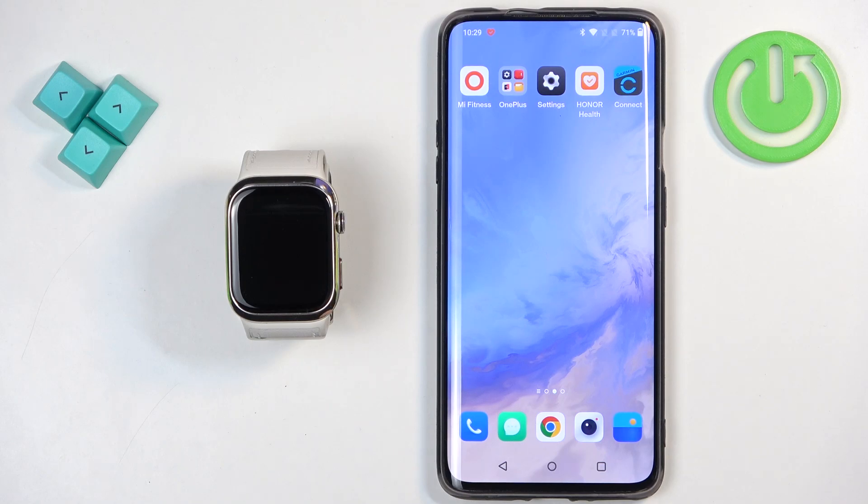Welcome. In front of me I have a Huawei Watch D2 and I'm going to show you how to pair this watch with an Android phone.